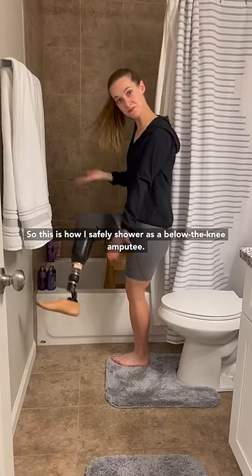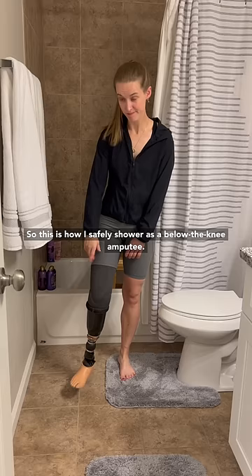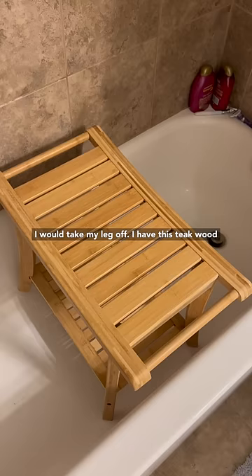This is how I safely shower as a below-the-knee amputee. I recently moved houses, so I have a new setup. Step number one: if I'm taking a shower, obviously I would take my leg off.